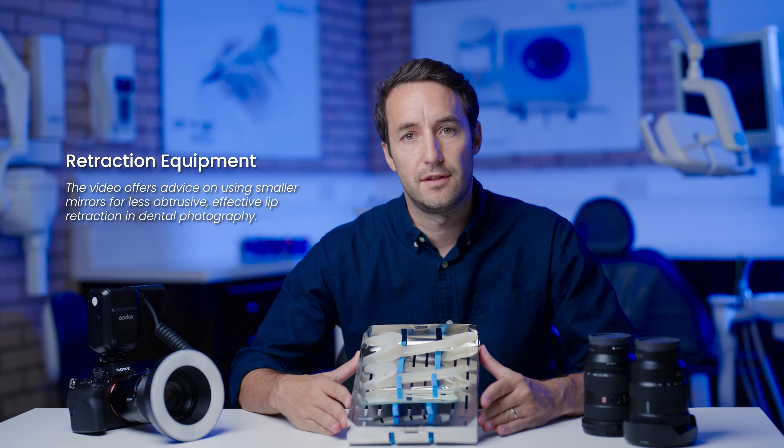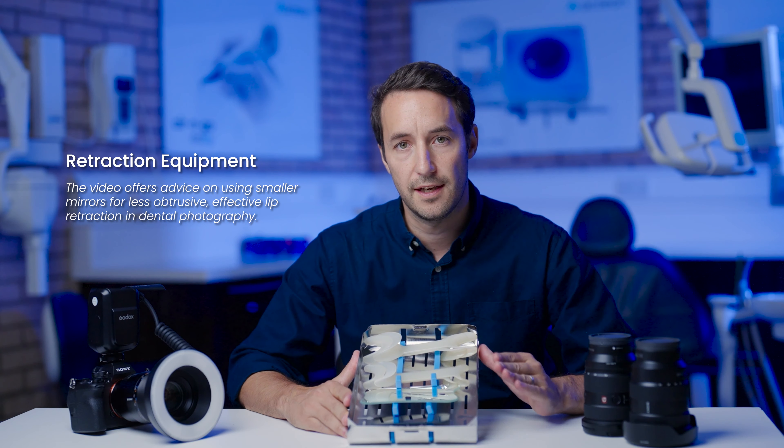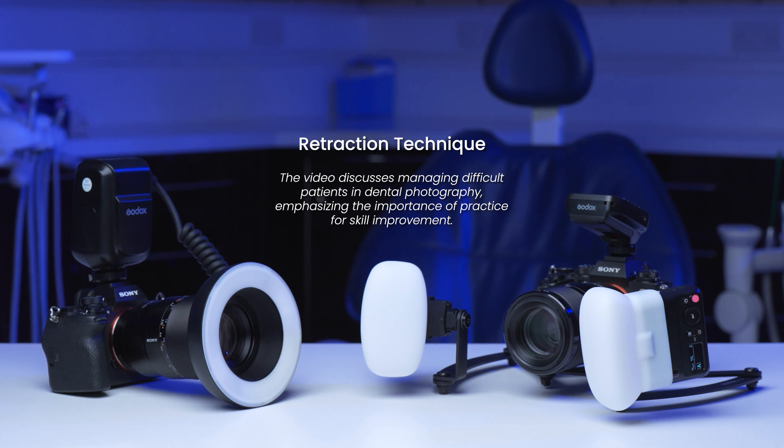This is a standard dental photography retraction and mirror kit that I use, contained within a dedicated low-profile aluminium tray. This step is obviously repeated when you're taking pictures from the other side.